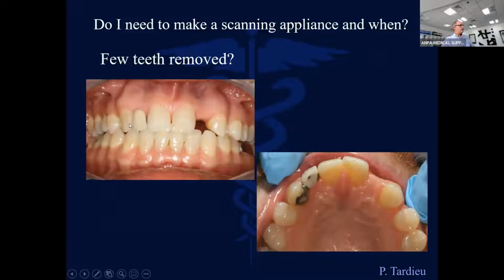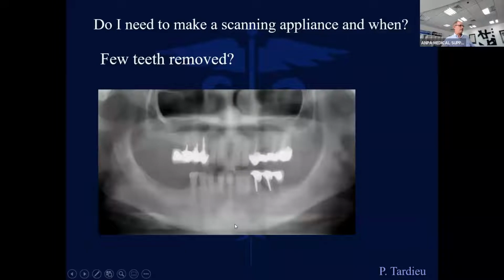You will encounter this kind of case with agenesis of the lateral incisors. The patient has had an appliance like this, which was bonded at the back of the incisors and canine on both sides. And this, as usually happens, was falling down and down and down. So one day, this guy decided to have implants to replace the teeth. But this is a grown-up guy, 54 years old. We could not start again doing orthodontic treatment. This is too late.